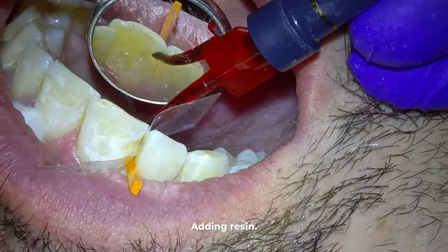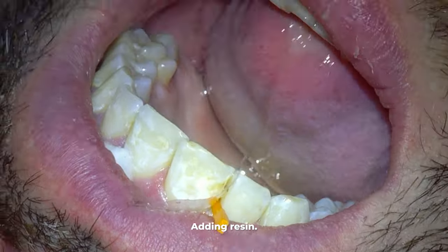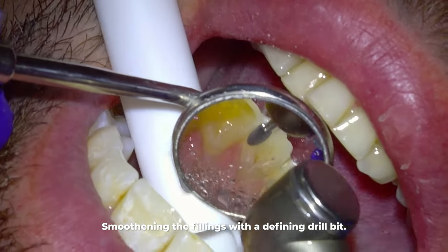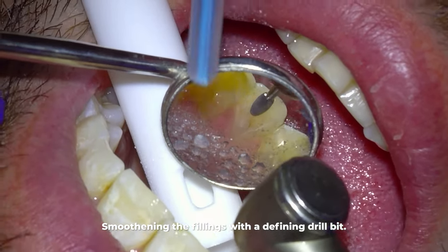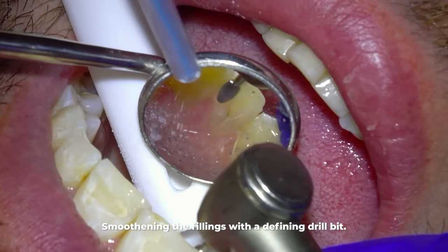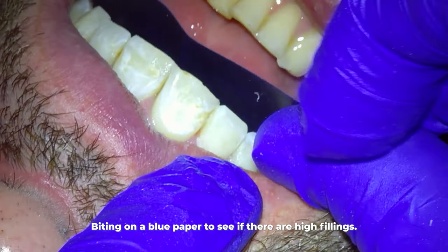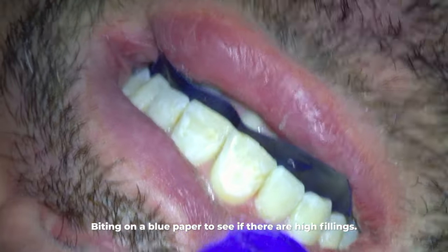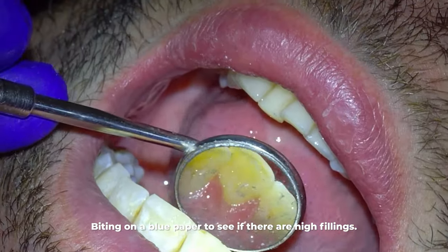These teeth won't contact each other very tightly if you don't use the wedge, so it helps overcompensate for that lack of space. Now that those are in place, we smooth these fillings with this refining drill bit. With my high speed drill we're making everything flush and smooth — one big reason you need these smooth is to prevent future staining from getting around the crevices of these fillings, so they need to be very smooth.